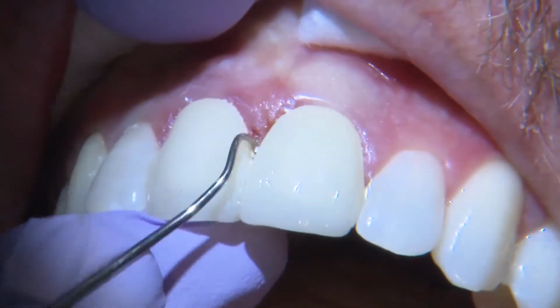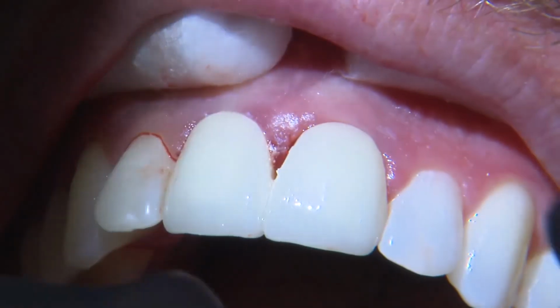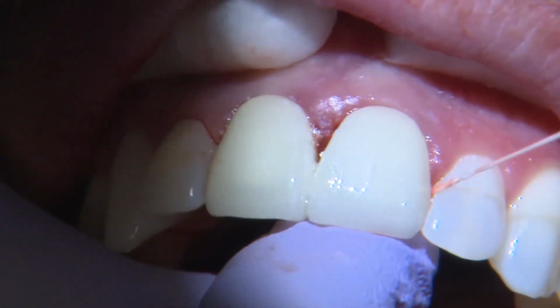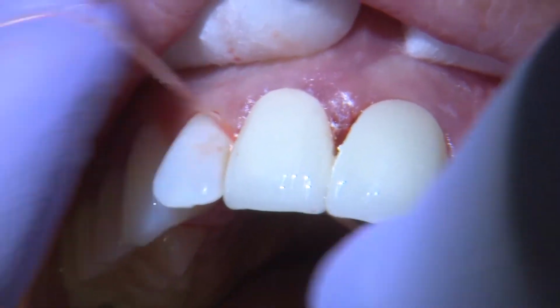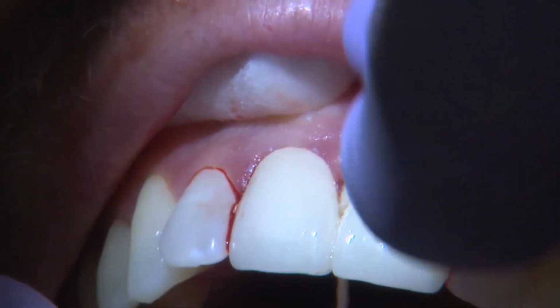And I'll go through and I'll double check with some floss. I like to tie a knot in the floss and run it through to make sure that interproximally I didn't leave any temporary cement. Also, in the interproximal space between teeth number 8 and 9, I like to use super floss and remove any temporary cement.